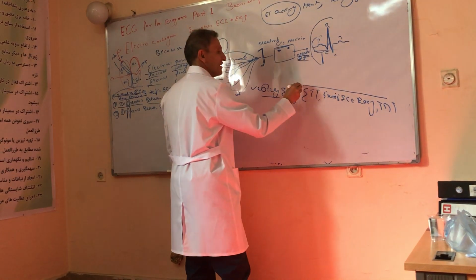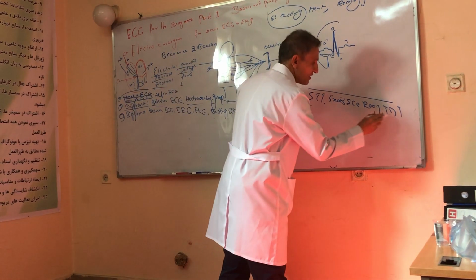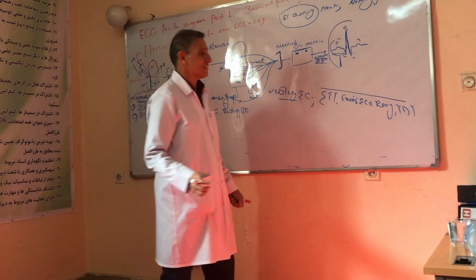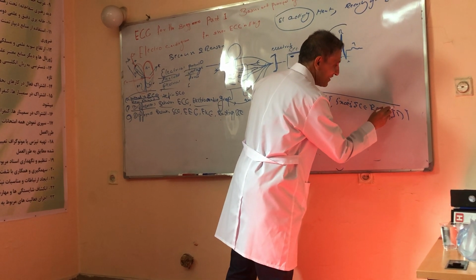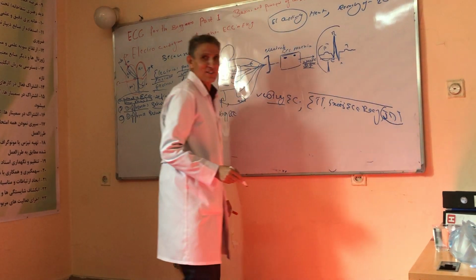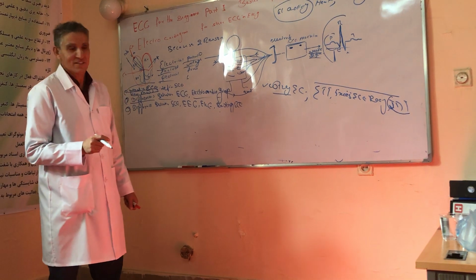These three terms give the same concept. But especially since this ECG is recorded over a treadmill, the other name is TMT or exercise tolerance test. So we'll discuss that a little bit later. TMT also is an abbreviation that we use for ETT.